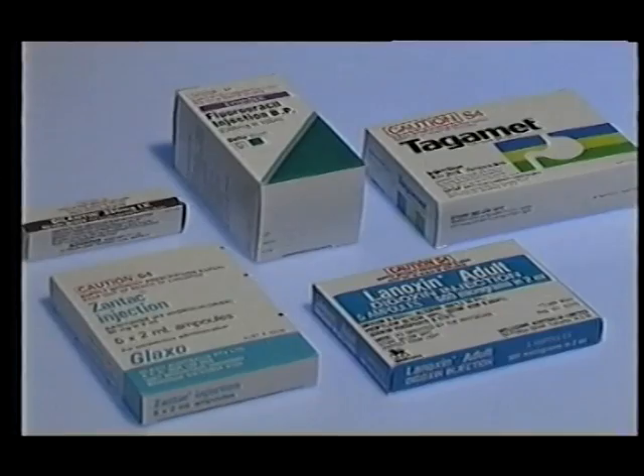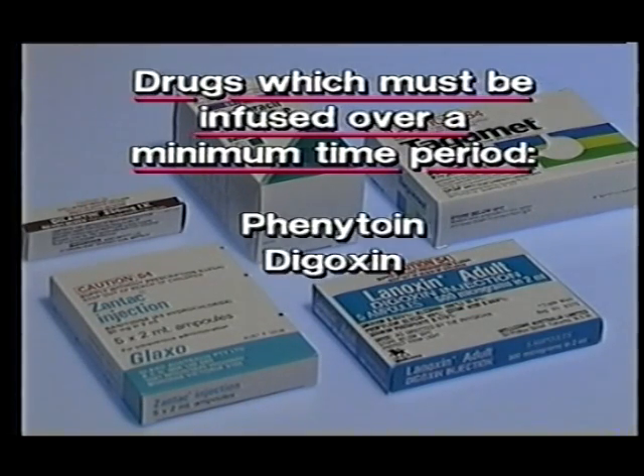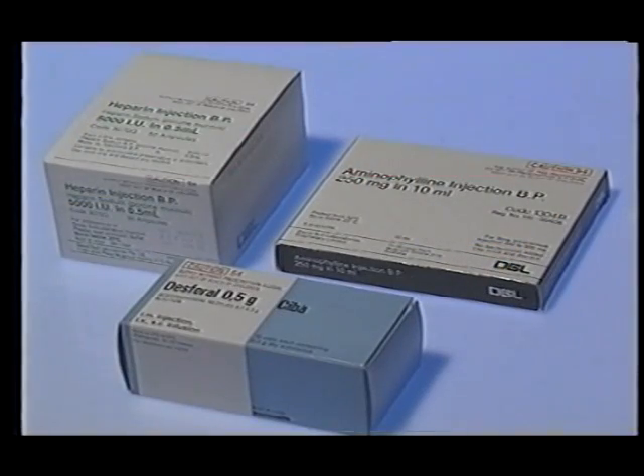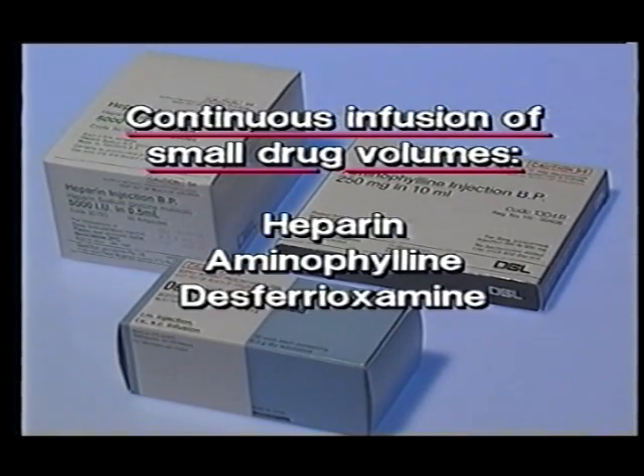The Spring Fuser is ideal for a number of applications. On wards where a lot of antibiotics are given manually, the Spring Fuser will considerably reduce the time taken for an antibiotic round, allowing other patients to be connected whilst the first patient is being infused. The Spring Fuser is ideal for those drugs which require infusion over a minimum time period to avoid toxicity, such as phenytoin, digoxin, cimetidine, ranitidine, and cytotoxics. It can also be used for continuous infusion of small drug volumes, notably heparin.